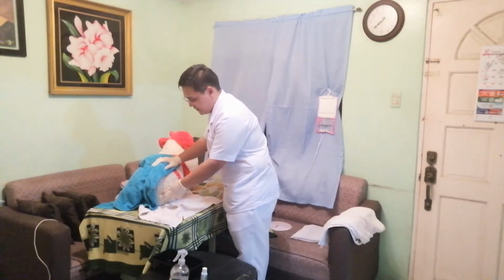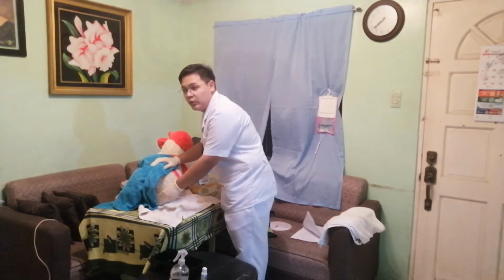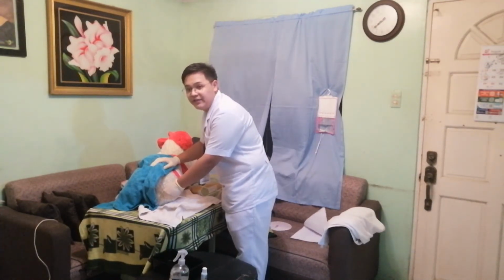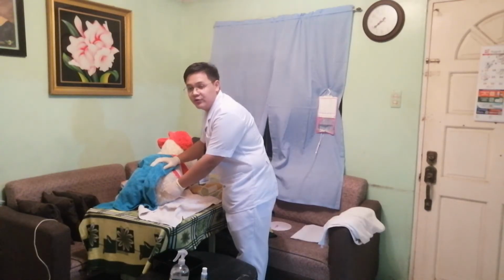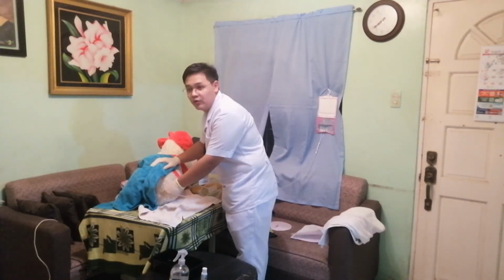Okay, so now we will need to administer the solution slowly. If our client reports pain or the experience of fullness, we will need to lower the solution container or close the clamp for 30 seconds and restart the flow at a much slower rate.